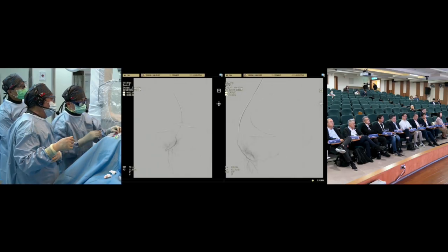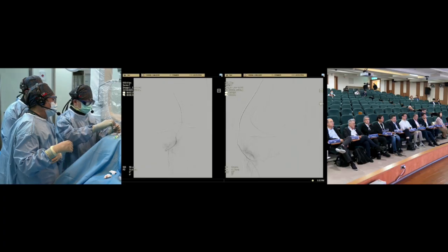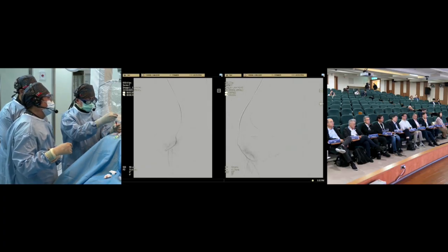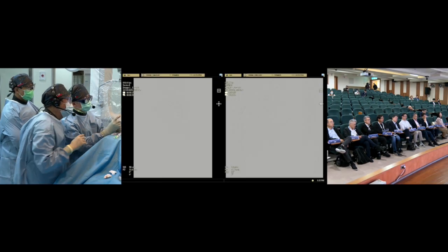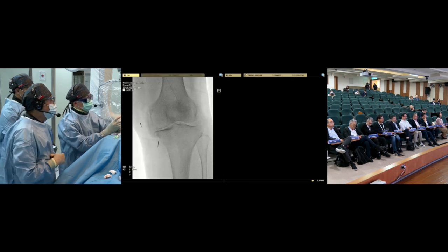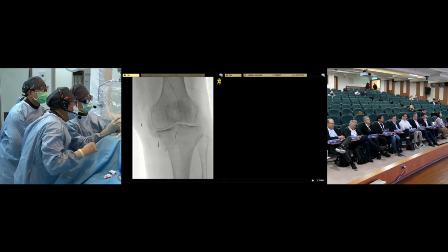So I will do the embolization and ask the patient, does she feel some evoked pain? Okay, so now we'll give some 1.5 ml. You don't need that much, 0.5 to 1 cc. Okay, we'll use 0.5 first. Don't give too much at one time. Yeah, that's enough.